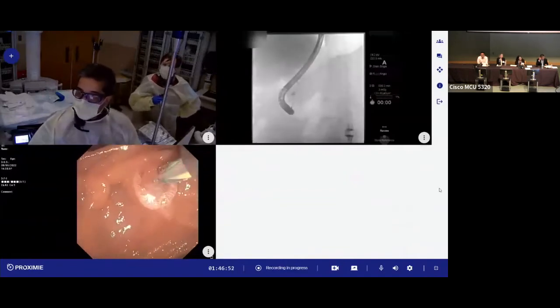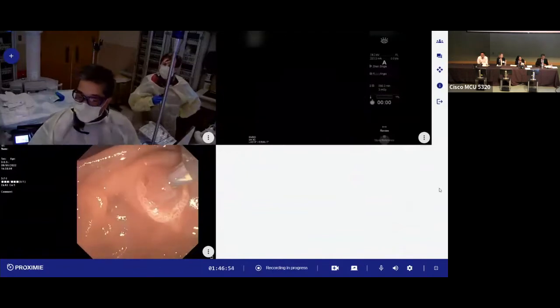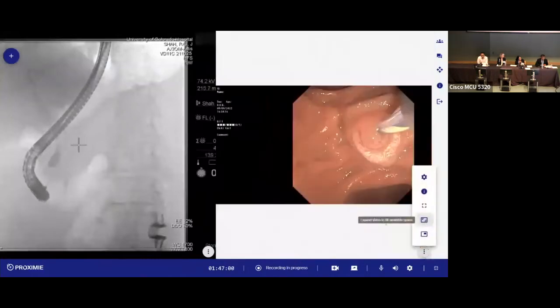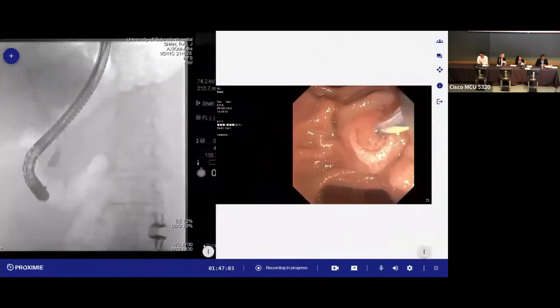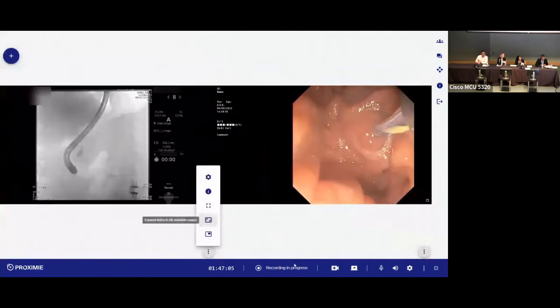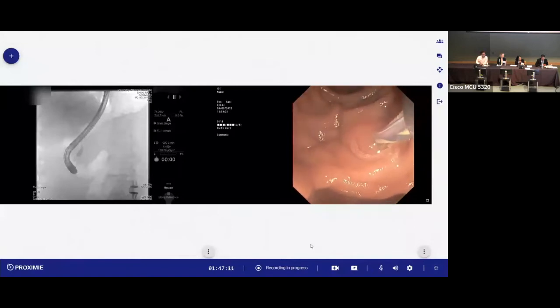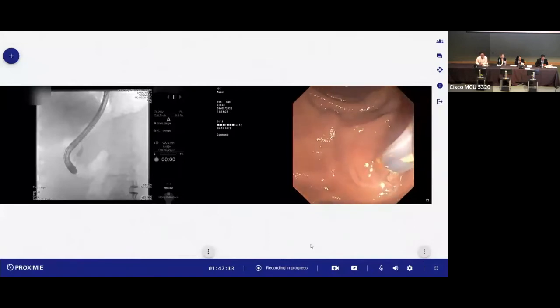And so endoscopically, there we go. Okay, break the wire to me. Can we get the short CRE balloons? I'm not sure yet. You can grab like a 10 to 12 and 12 to 15 maybe. But you can see endoscopically, my opinion regarding the endoscopic position here, I'm going to inject a little more. And we did give antibiotics.